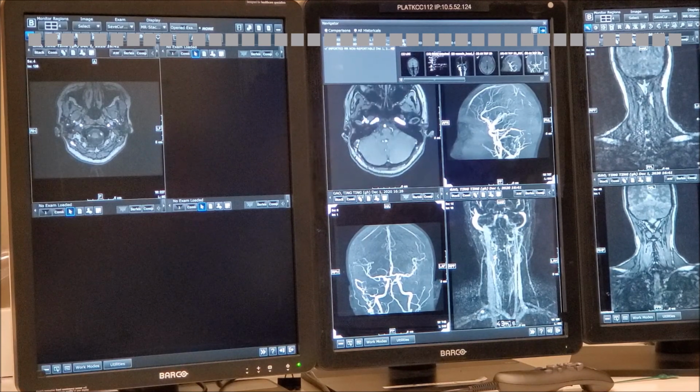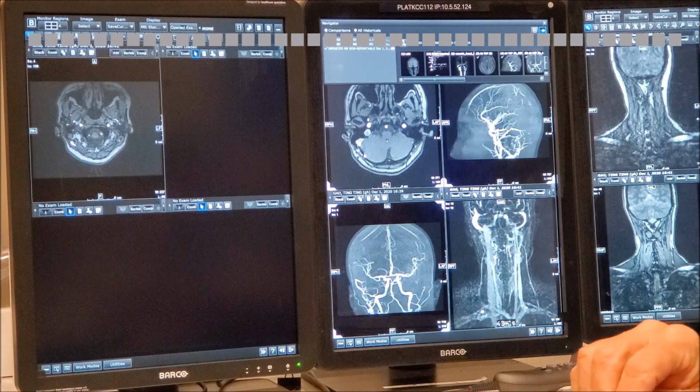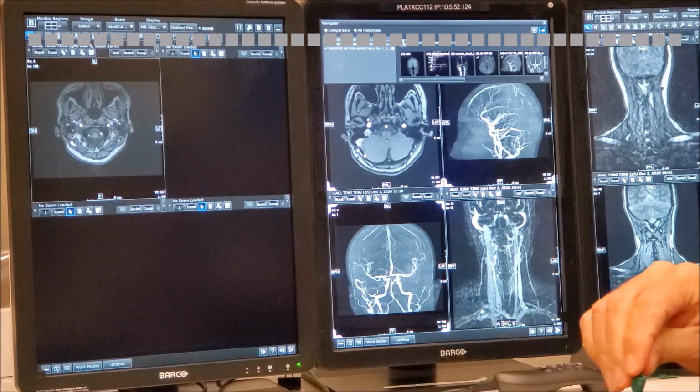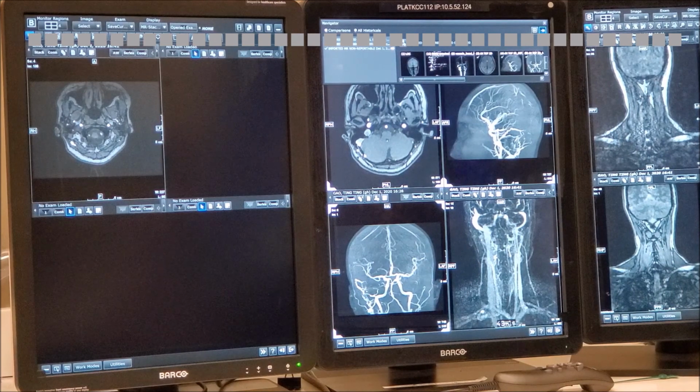Whenever you see that, what do you think the etiology of this disease is? It's a dural fistula, right? We can see it very nicely here. So when you're looking at a patient with a dural fistula, anywhere, you look for the arterial supply and all that. But what is the pathophysiology of the disease? So from what I've read, the dural sinuses have some arteries that feed the wall. And then they form the connections.